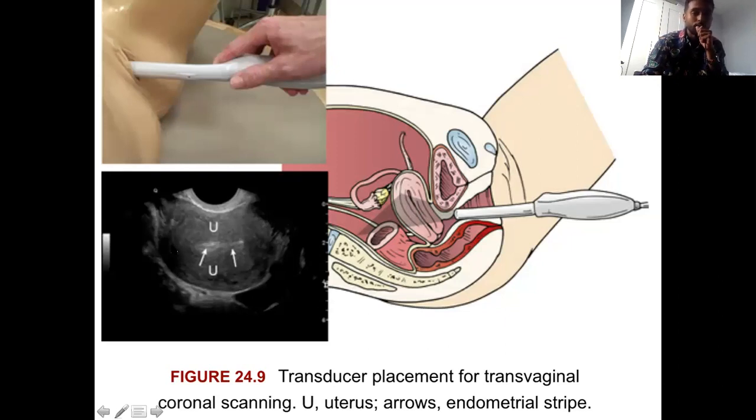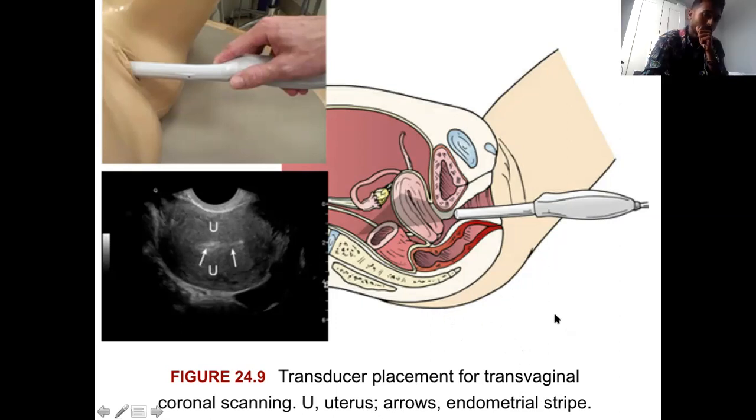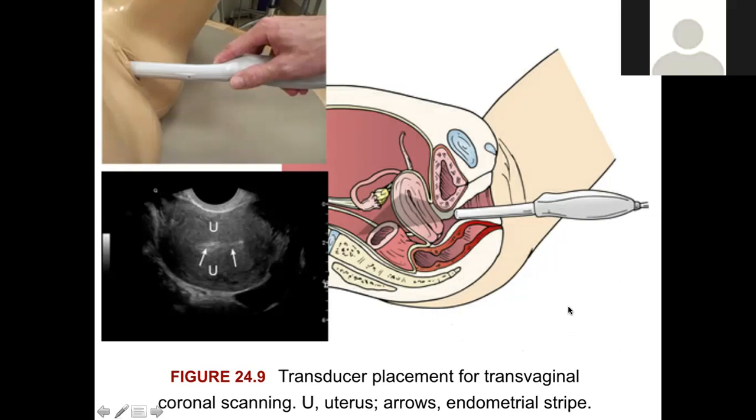And on this view, you'll see the ovaries to the right and left. To do that, you just turn the transducer more laterally each side to get a view of each. And for the uterus here, how you scan it is, you fan the transducer up and down like this, and that's how you scan through the uterus. You get what I'm saying? Yeah. Are you confused? You good? Yeah, no, it just took me a while to register that.